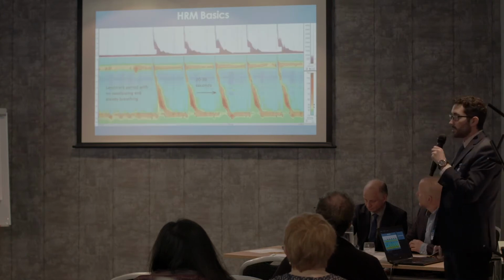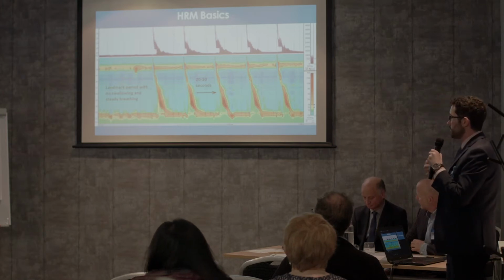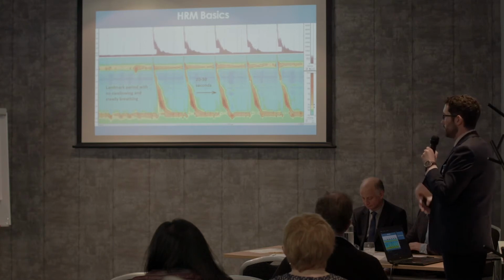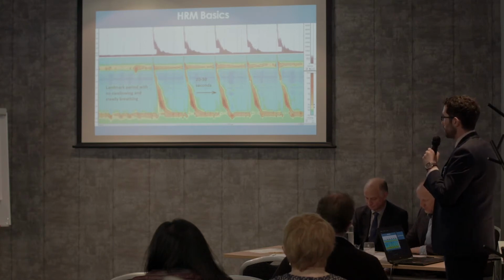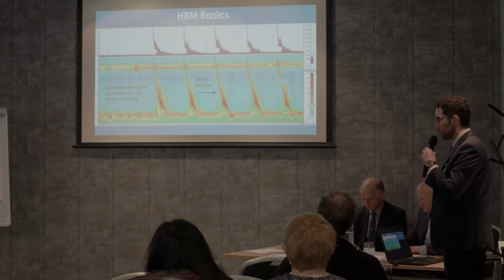When you are doing your trace, make sure you get a good landmark period. This will make sure that you can confirm where the anatomy is and everything's in the correct place. But also you need that for your resting pressure of the LOS. And that no swallows in between and a good 20 or 30 seconds between the swallows.